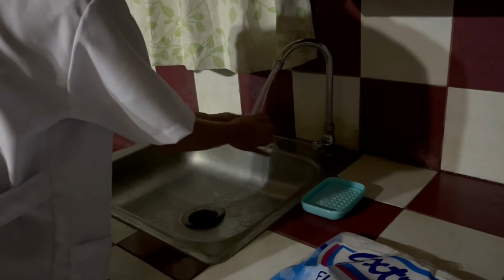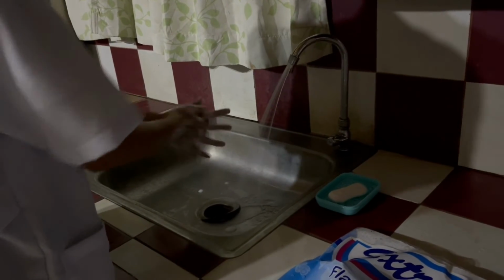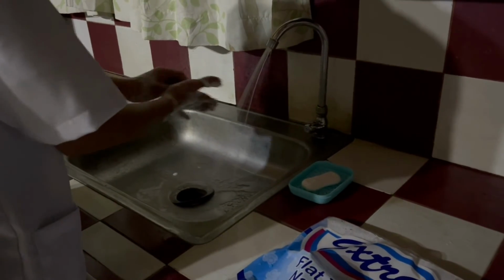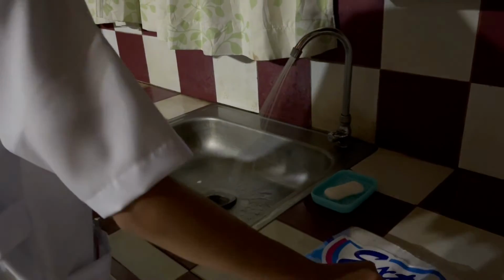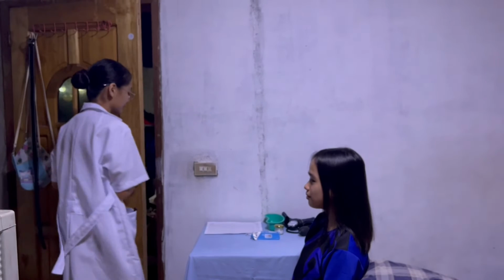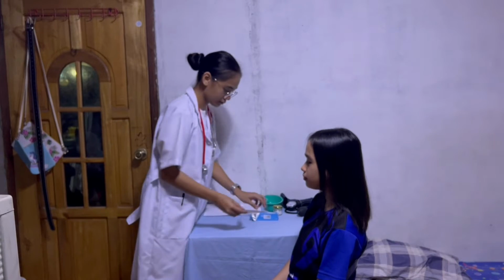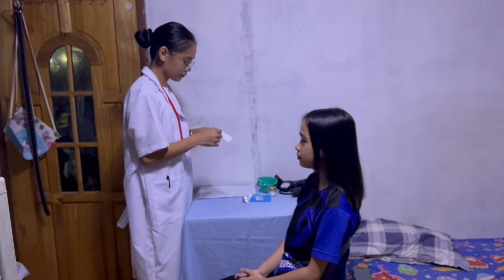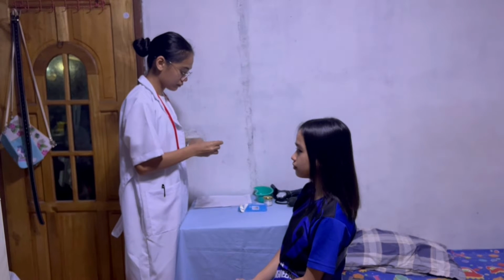Perform hand hygiene and observe appropriate infection prevention procedures. Washing hands can minimize cross infections. Provide the client's privacy by closing the door. Position the client appropriately. Apply a protective sheath to provide a barrier to prevent transmission of organisms.